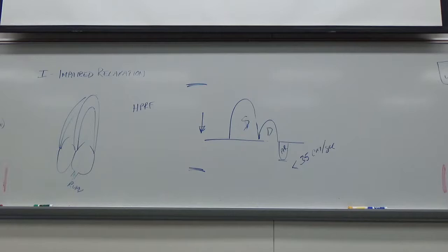Okay? If my scale's set too high and I move my depth all the way down, high PRF kicks on automatically. You're going to have difficulty even seeing a waveform. It's going to be a lot of noise, and that's because of the high PRF. So to fix it, drop your scale down on the spectral scale, and then it should be fine.